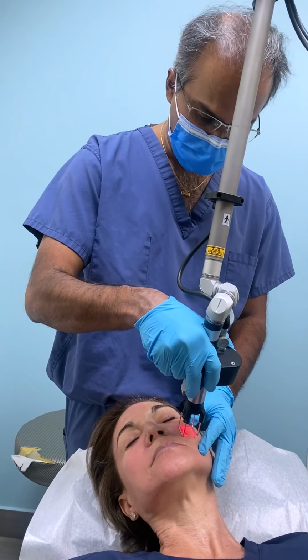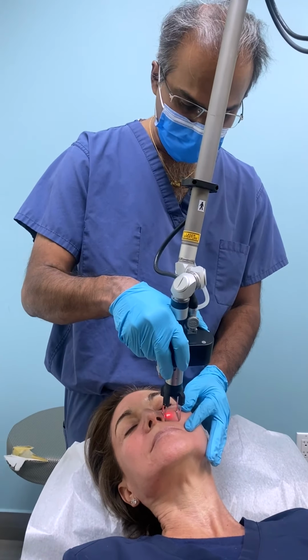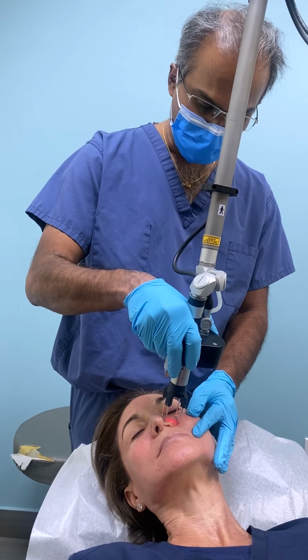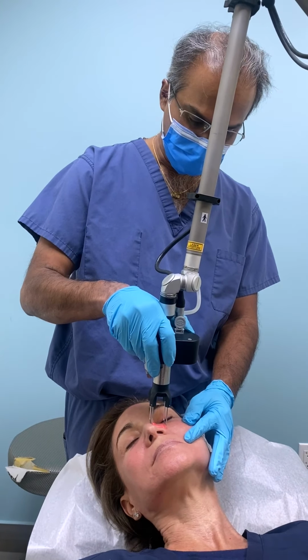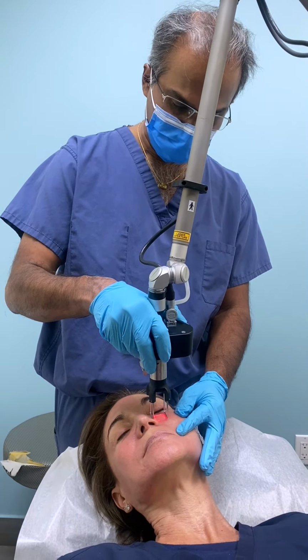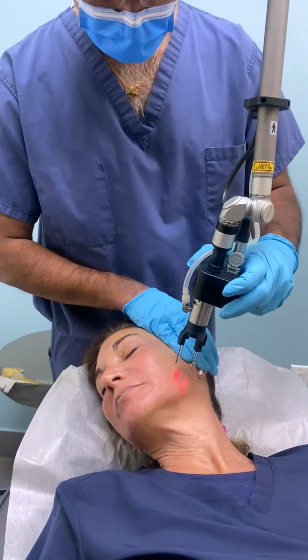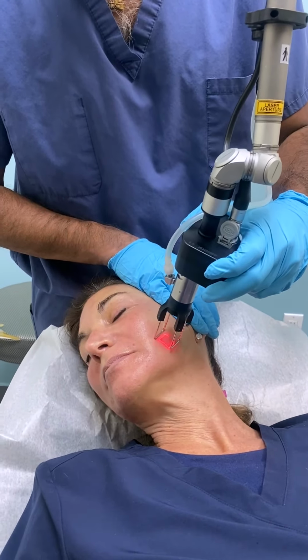And the better treatment nowadays, anyways, is to really give patients the option to do what we call combination treatments that use multiple different types of devices that do different things and work at the same time, at the same setting when you do the treatment. So over the course of healing, they're all working together. And that's a better way to manage somebody's skin than just blasting them sometimes.